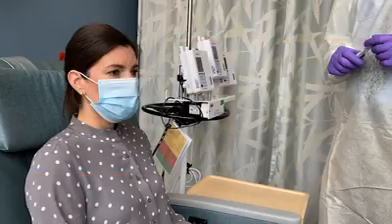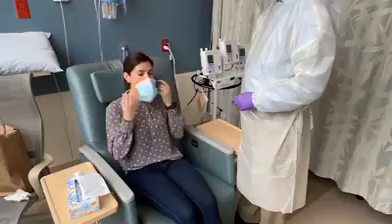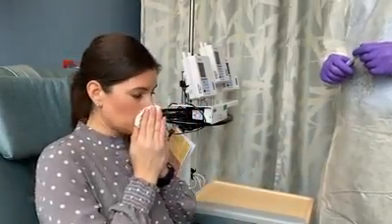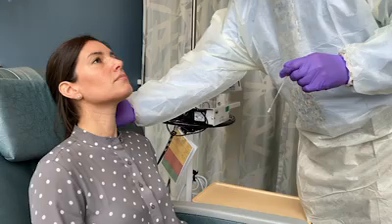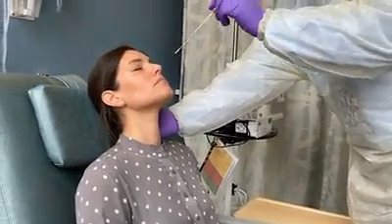Masks are recommended for all patients suspected of having COVID-19. Have the patient take off her mask and blow her nose into a tissue to clear excess secretions from the nasal passages. Remove the swab from the packaging. Tilt the patient's head back slightly so that the nasal passages become more accessible. Ask the patient to close her eyes to lessen the mild discomfort of the procedure.